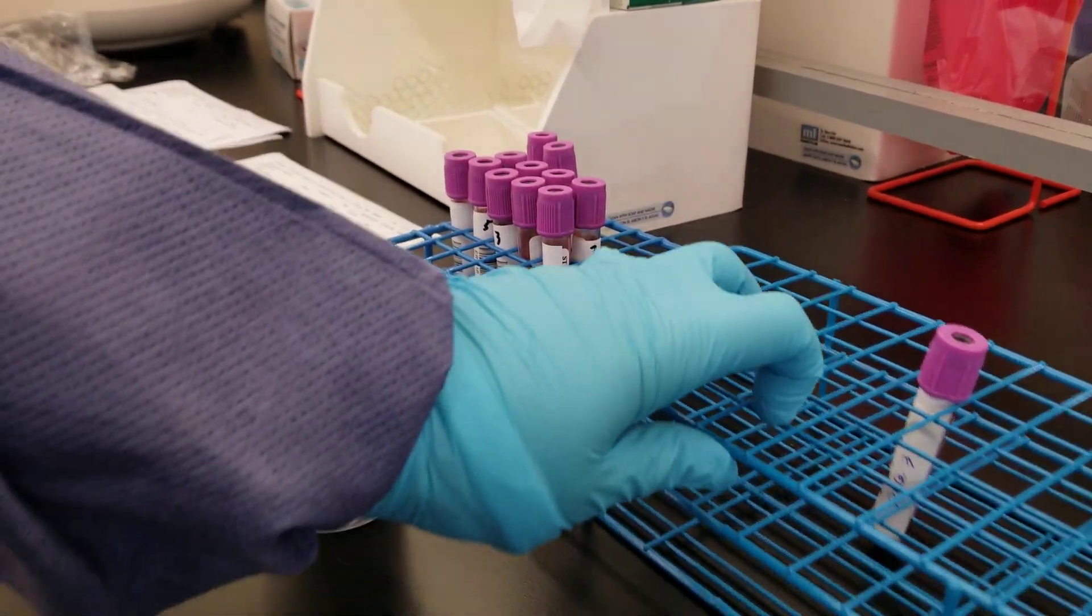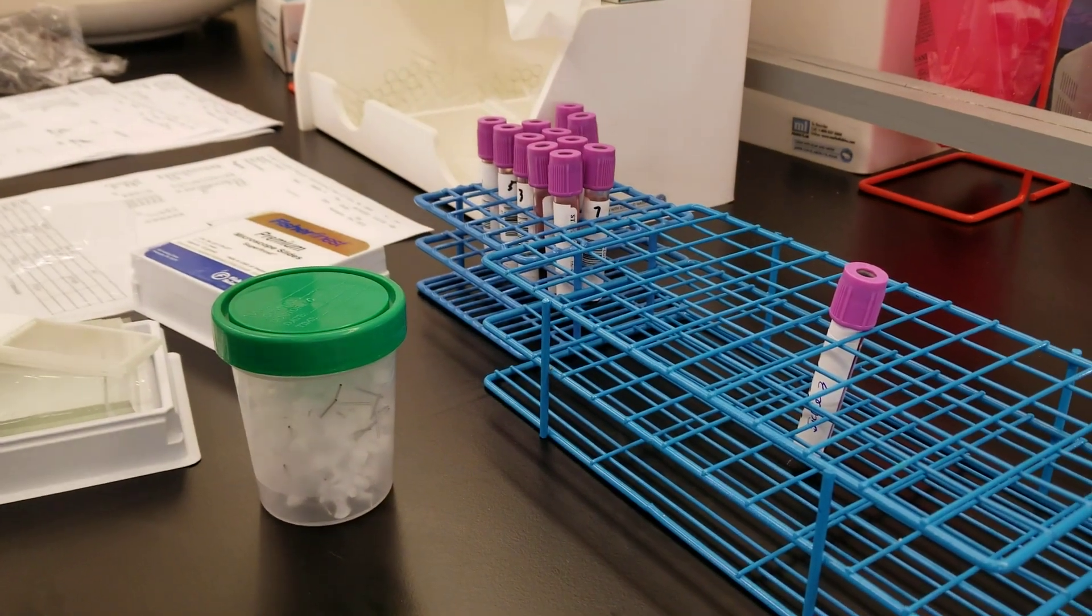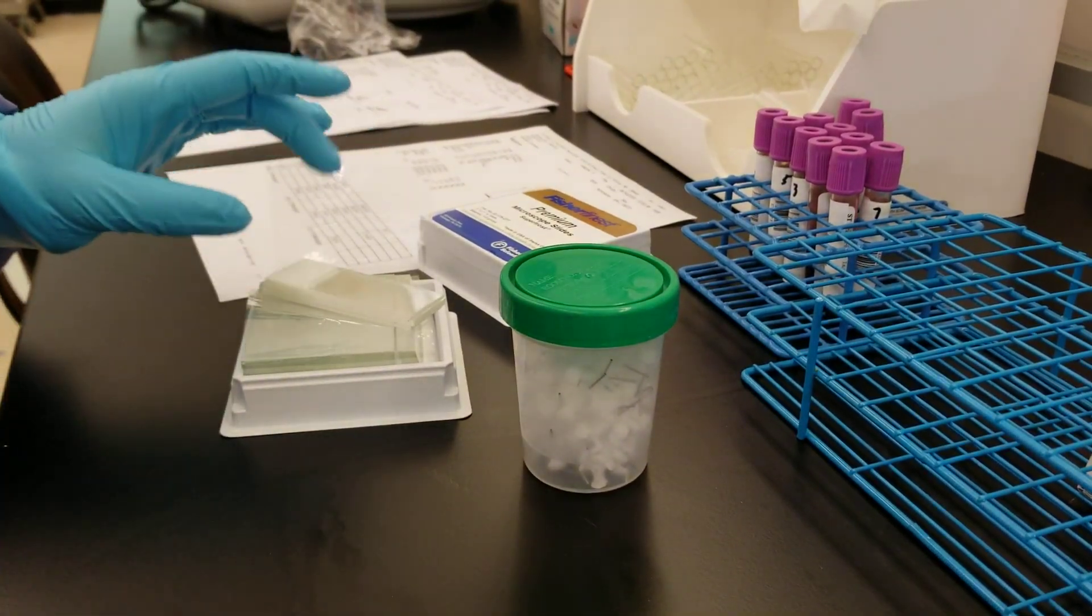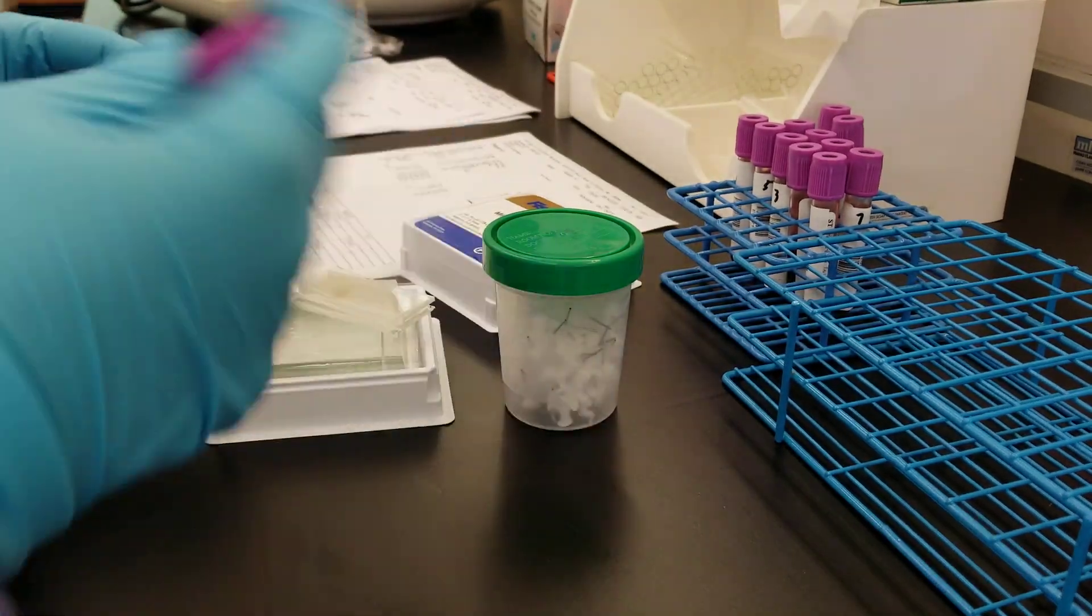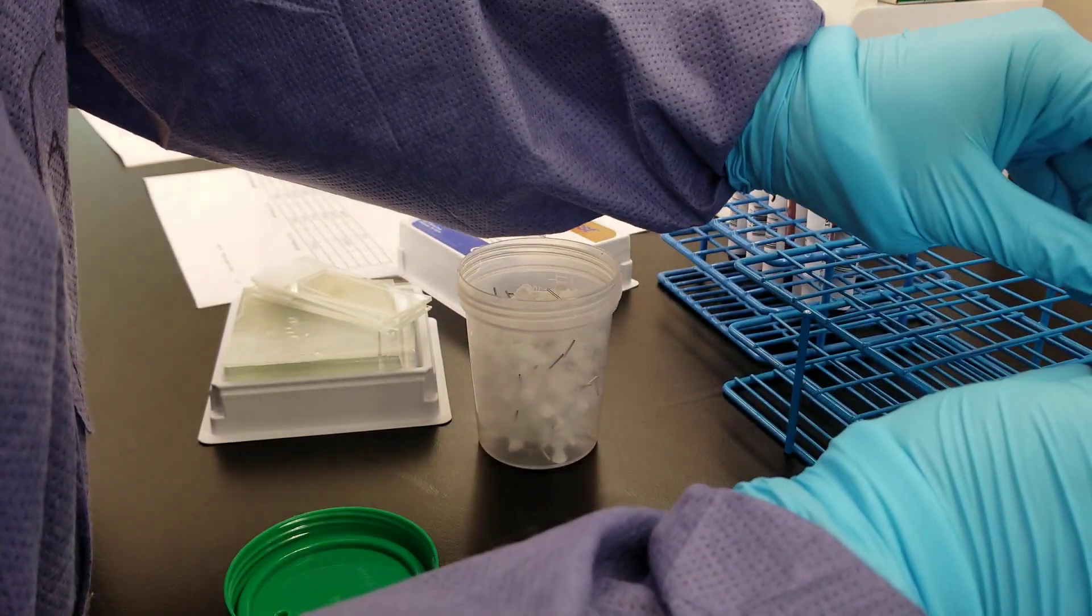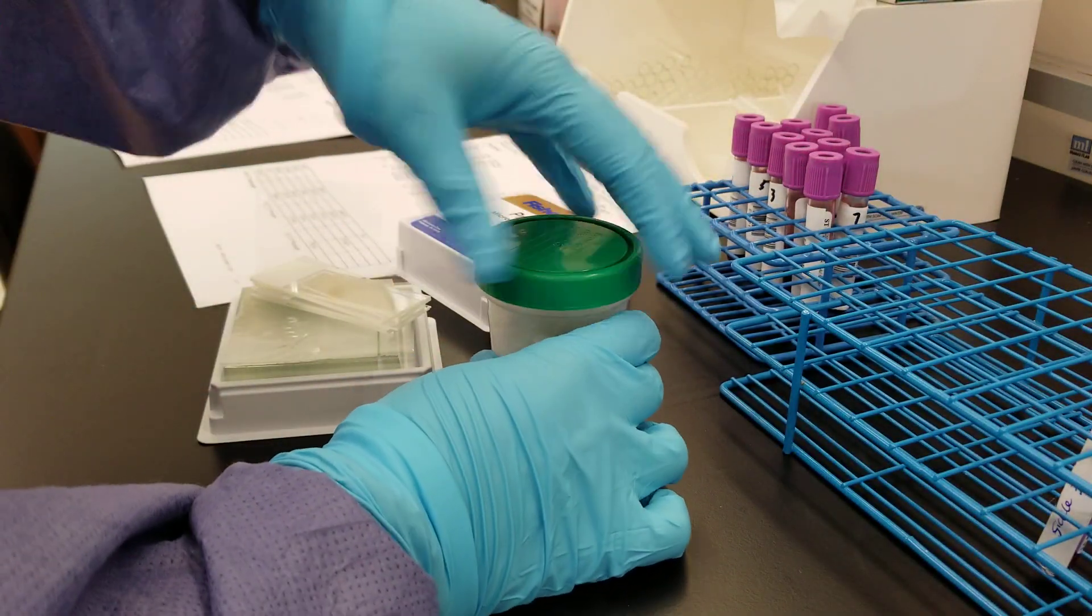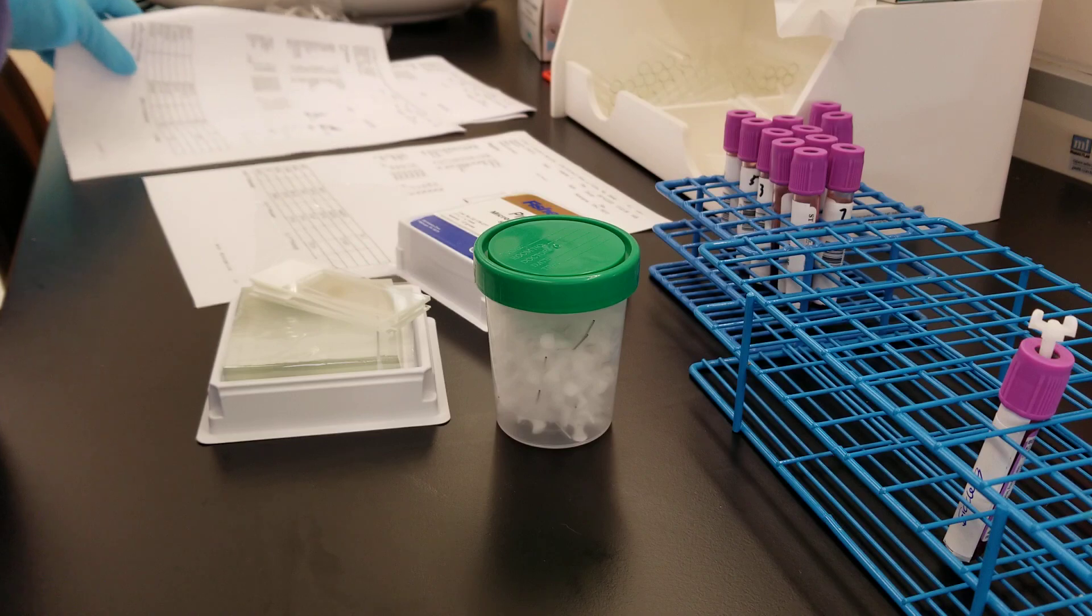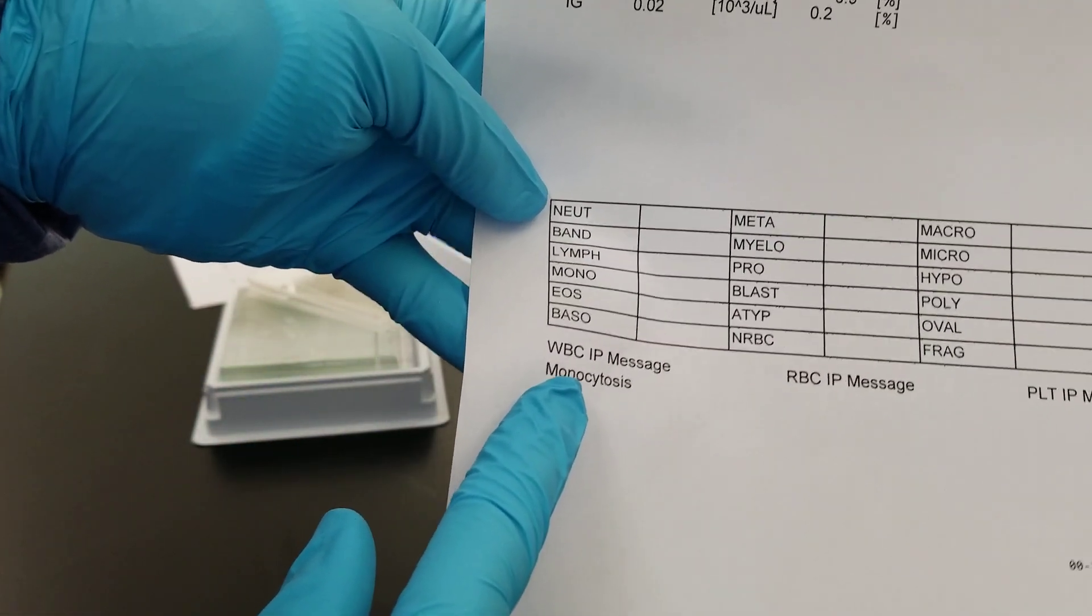Today we're going to be making slides of the positives that we had with our run of specimens on the XN 550. I'm going to show you how I make them. It's different from what you would see in the book and it's a little different from the other video that I showed you. So I'm putting a diff safe in one of our positive sickles. One of our sickles did come up positive here and monocytosis was the flag.